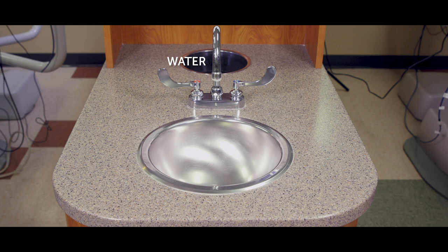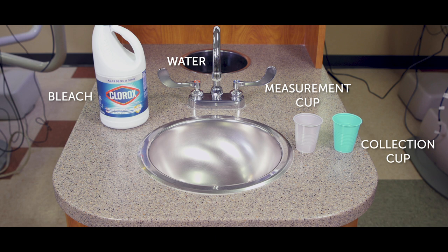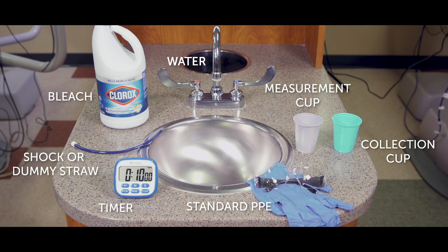You'll need tap water from your faucet, bleach — regular old household bleach — a measuring cup, a collection cup, a timer, and latex gloves. If you're using a straw treatment, you'll need a shock straw or dummy straw. We're using a kitchen timer, but you can use your phone or watch — just make sure you have an alarm to alert you when the time is up.